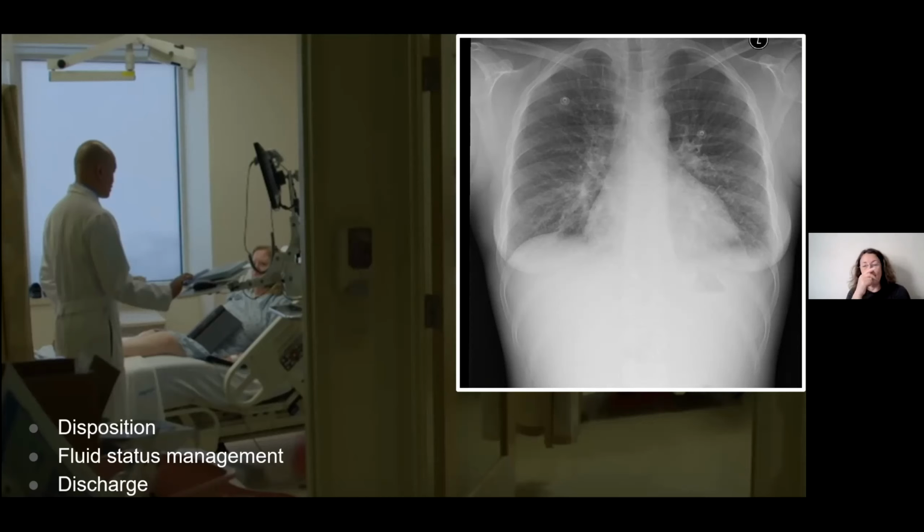Then as the patient stays in the hospital, chest X-ray images are taken at intervals of time, probably once a day or even more frequently if there is a need to monitor the fluid status in the lungs more frequently than once a day. And based on what the physicians see in the images, they adjust medication to treat the patients.